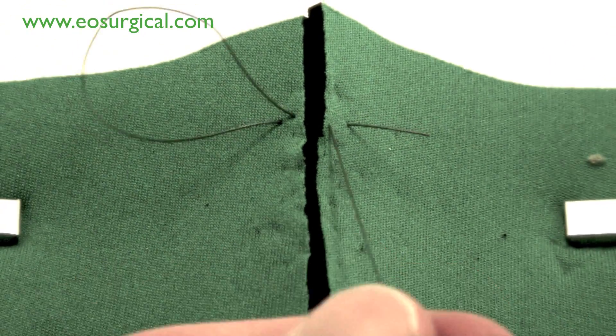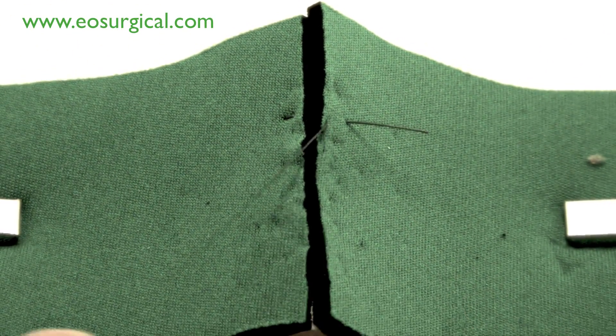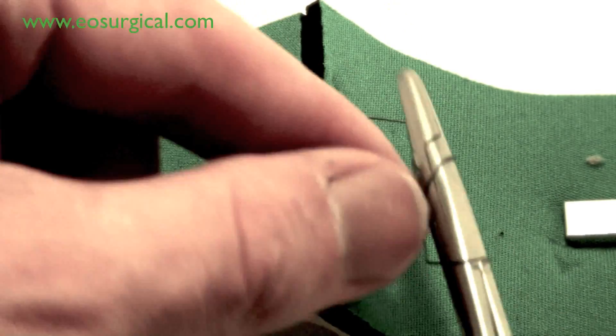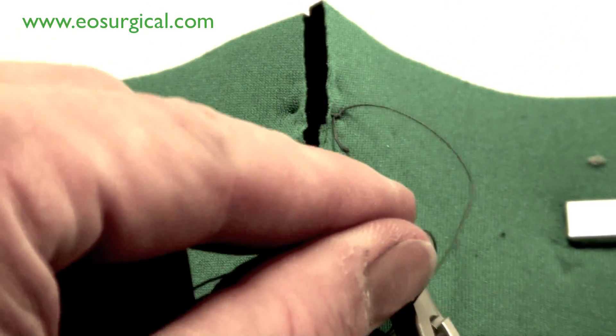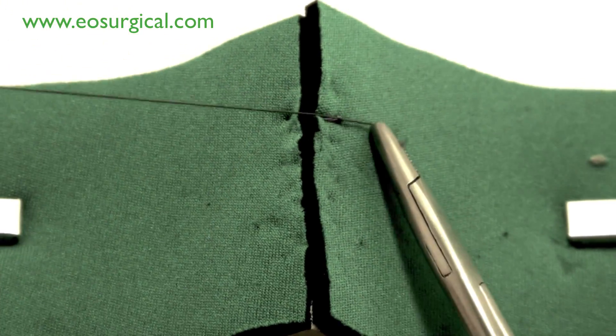Now you can see when this knot is tied just in a simple instrument tie that will cause the wound edges to evert up and to almost pout up. That's very desirable in some high tension wounds.